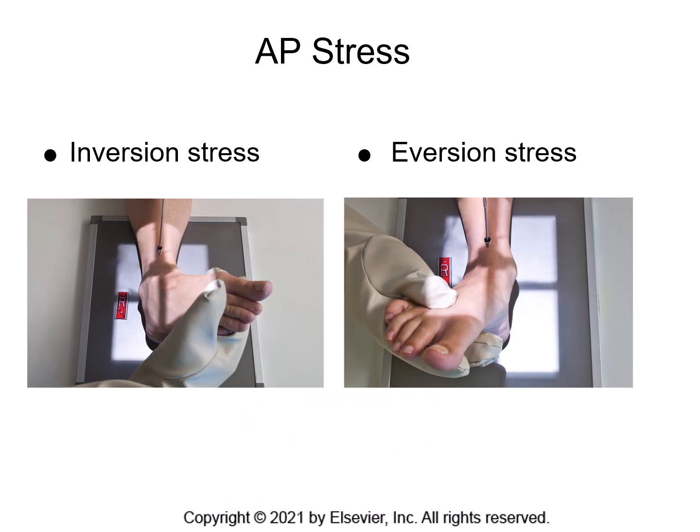All right, so the first picture here is the inversion, where the foot is being forced medially, internally. It's called inversion of the foot. And then eversion is where they take the foot and stress it laterally, away from the body, eversion stress. Notice that this person has a leaded glove on. These positions are done with the stress being placed on the ankle during the exposure.